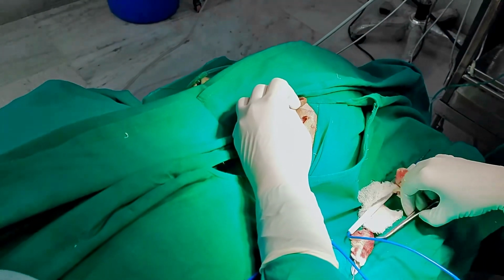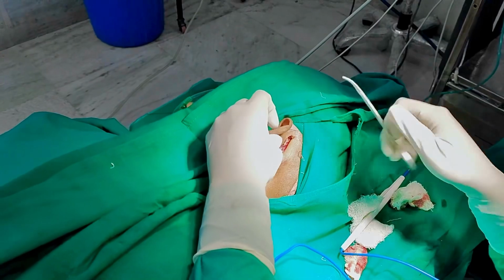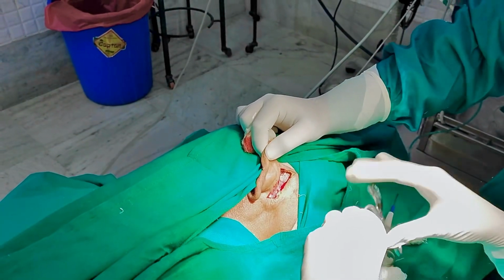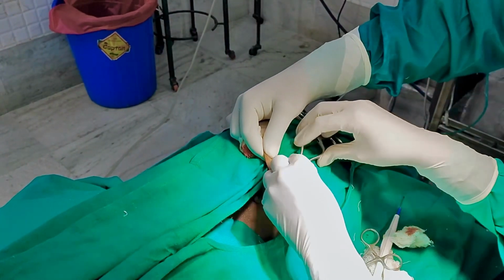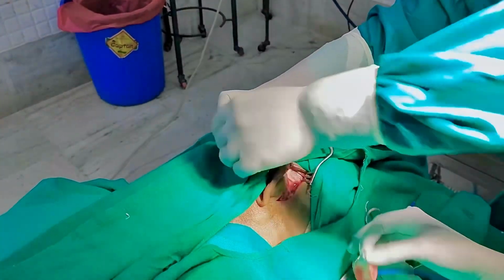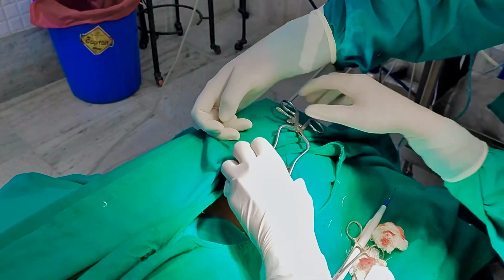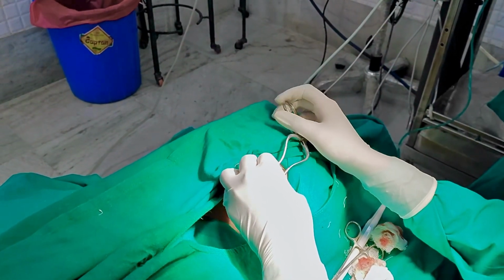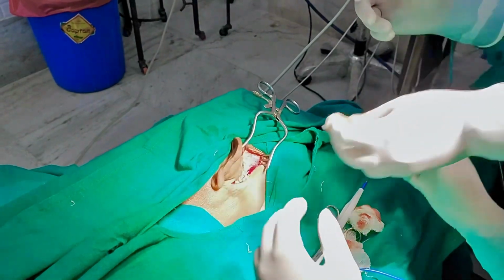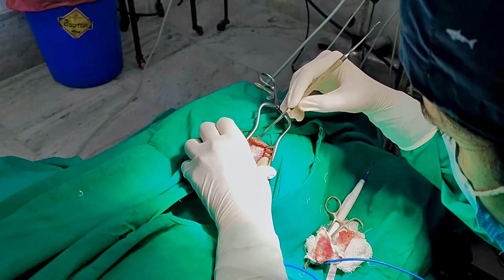So here the incision that has been made is the post-auricular Wilde's incision, which is usually made 0.5 to 1 centimeter behind the post-auricular groove. Now after the initial incision and dissection of the subcutaneous tissue, this part is showing the harvesting of the temporalis fascia graft. So as we can see, the area of the temporalis fascia has been exposed, and we can see the attachment of the Mollison's self-retaining hemostatic mastoid retractor. As you can see, it is staying in place without the surgeon's effort.